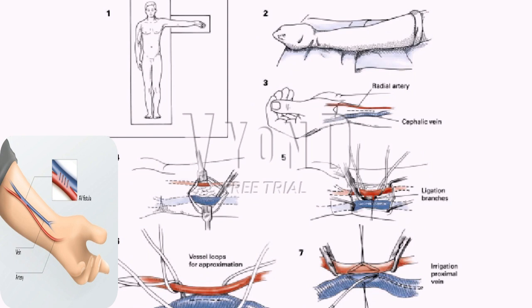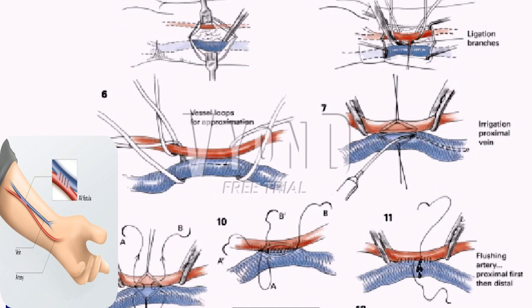A longitudinal venotomy is made in the cephalic vein with a No. 11 blade and extended for 1 cm with iris scissors. The vein is dilated to 3.5 mm and a elastic catheter is passed cephalad to ensure patency of the vein. The vein is then irrigated with heparinized saline.